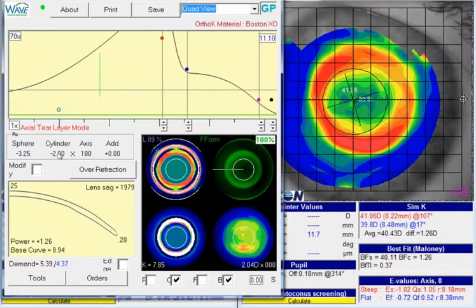With 2 diopters of cylinder and about a diopter and a quarter remaining in the refraction, post-wear refraction, I also think it's not a bad idea to go ahead and do an oval optic zone and correct some of the toricity that way. In the right eye and the fellow eye, I think we had a diopter and a half, and it seemed like it molded out pretty well. But if it's not going in the left eye, then that's certainly a possibility to get more correction.